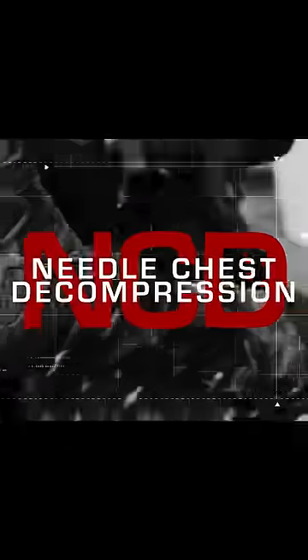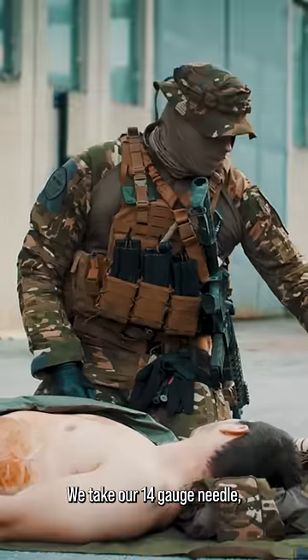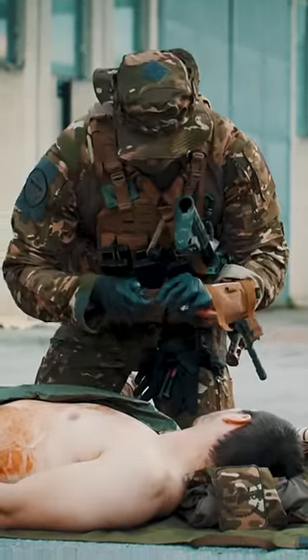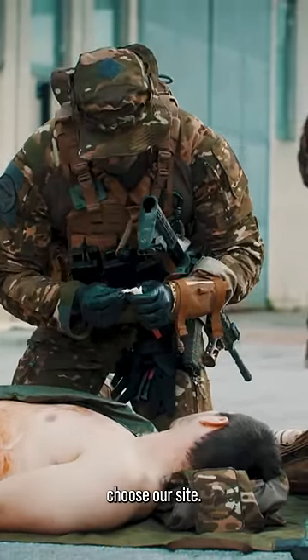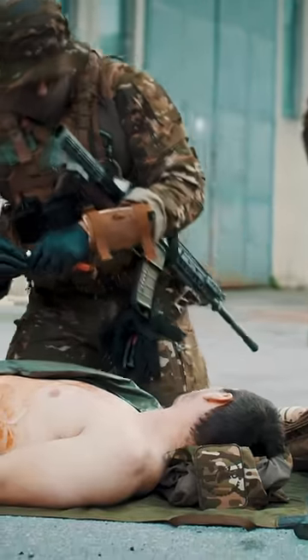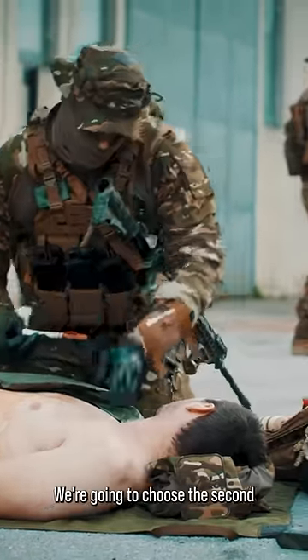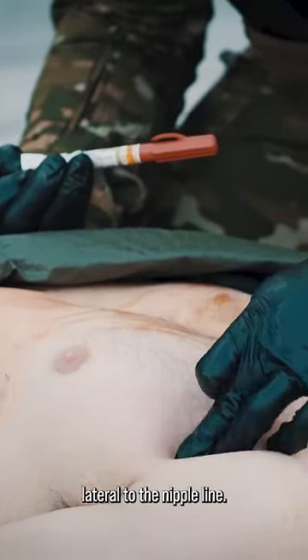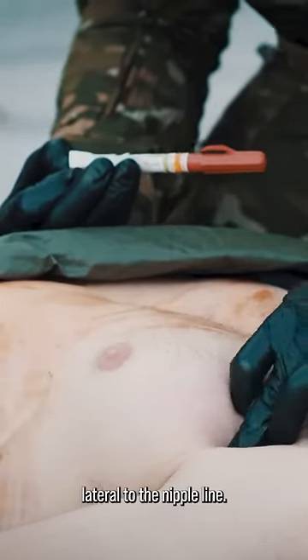We're going to do a needle chest decompression. We take our 14-gauge needle and choose our site — the second intercostal space, mid-clavicular line, lateral to the nipple line.